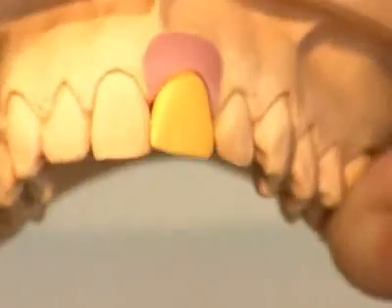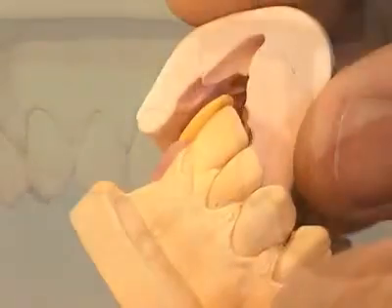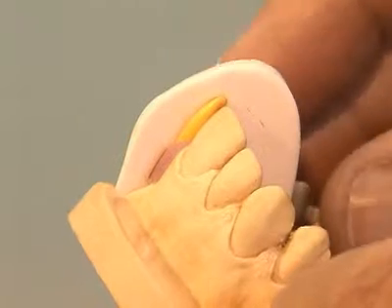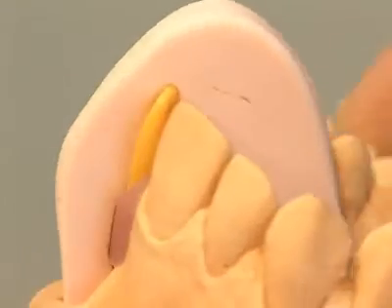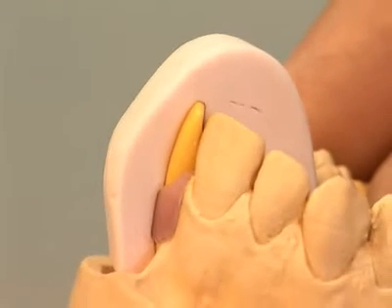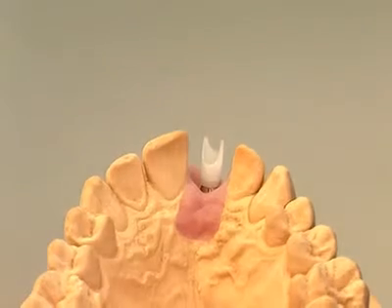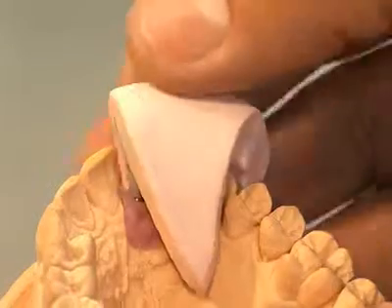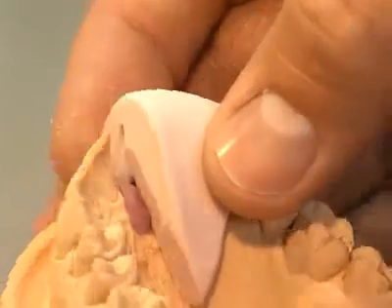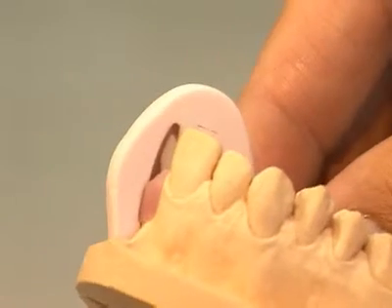For optimal aesthetic planning, a wax-up has to be modelled. Then a silicone key will be made over the wax-up and splinted in two parts to define the optimal wax modulation for the customized abutment. The silicone key shows exactly the space for the cement-retained crown, which will be made over this customized abutment.